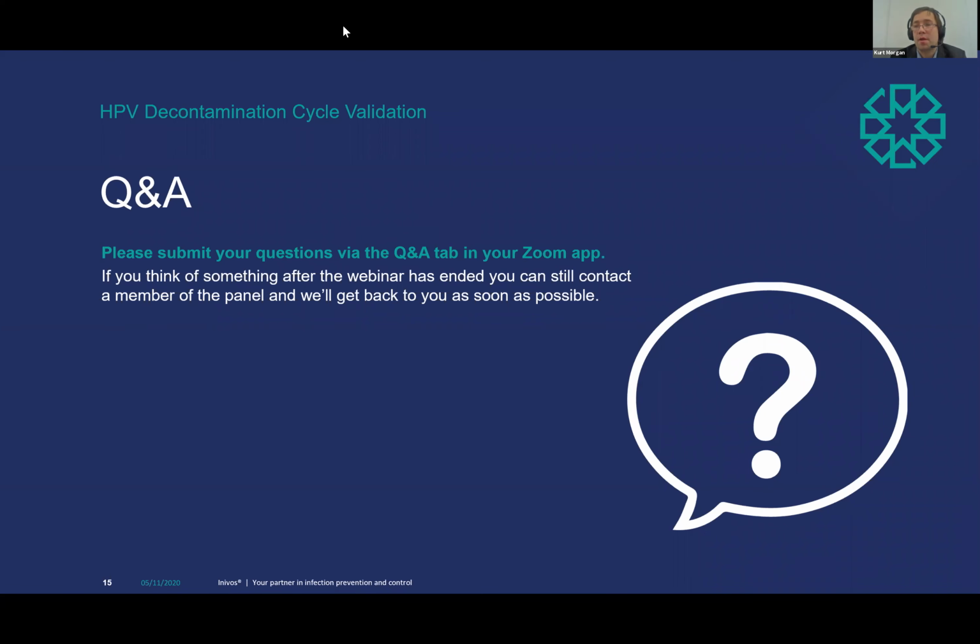I think there's a follow-on question to say that people understand what impact humidity has, but why do the systems allow for the different levels of humidity? Do you want to comment on that, Kurt? Unfortunately, humidity has some fixed levels. You can't go more than 100%. If you go more than 100% humidity, then we get rain inside a room, and that rain is not hydrogen peroxide; it would be water, and it'd be reducing the concentration of solutions on the surfaces, making the process less effective.